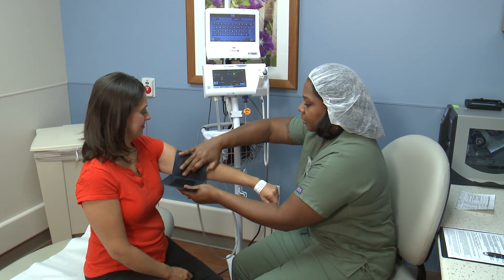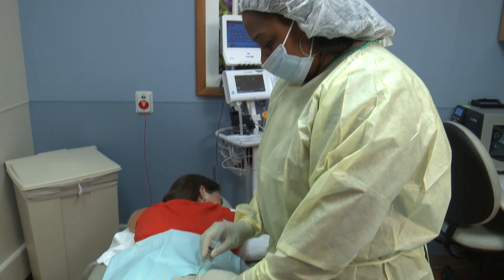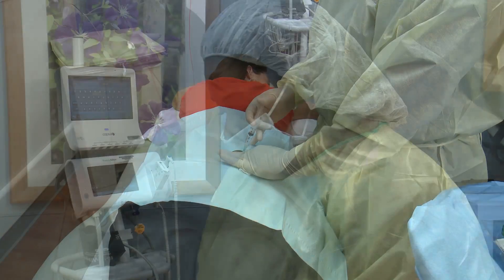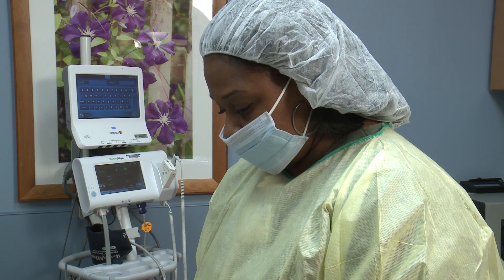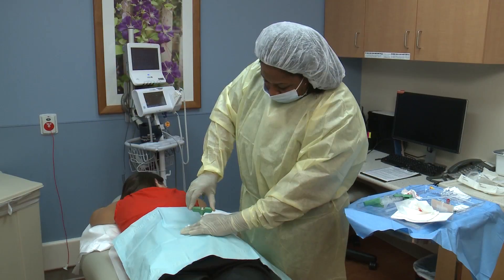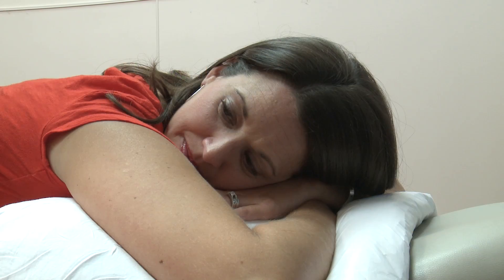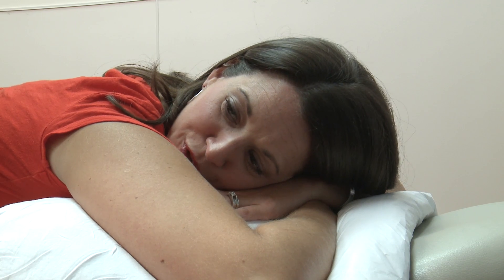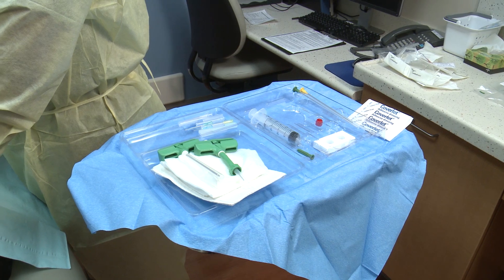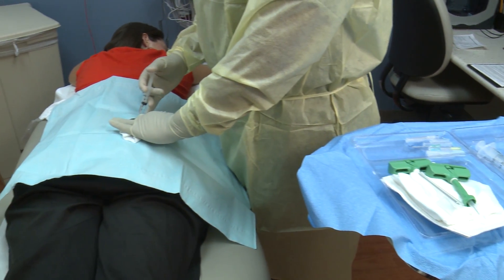A nurse will take your vitals. You will lie on either your stomach or your side during the procedure. If you are having a bone marrow aspiration, liquid blood marrow will be taken. If you are having a biopsy, a solid core piece of bone will be taken. You may feel slight discomfort during the procedure as the marrow shifts. This feeling should not last more than a few seconds. Extra lidocaine may be given, if necessary, to make the procedure as painless as possible.